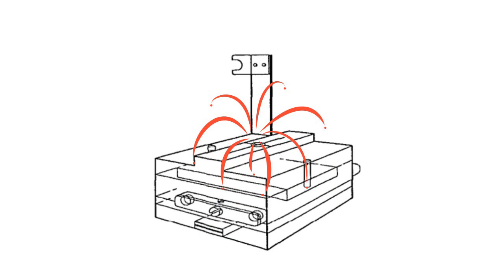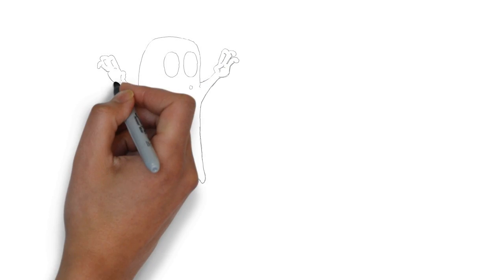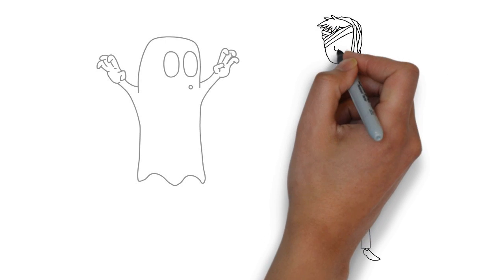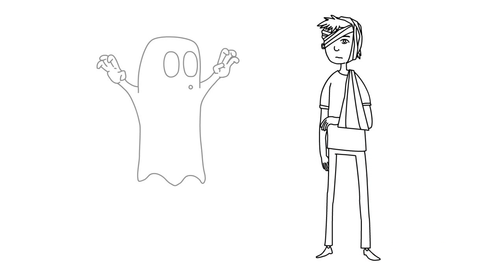For these QC tests, the physicist will record dose measurements using either phantoms or using patients. Phantoms are usually preferred because there's more standardization and control. Also, since they don't need to worry about ALARA, they can repeat the tests over and over.